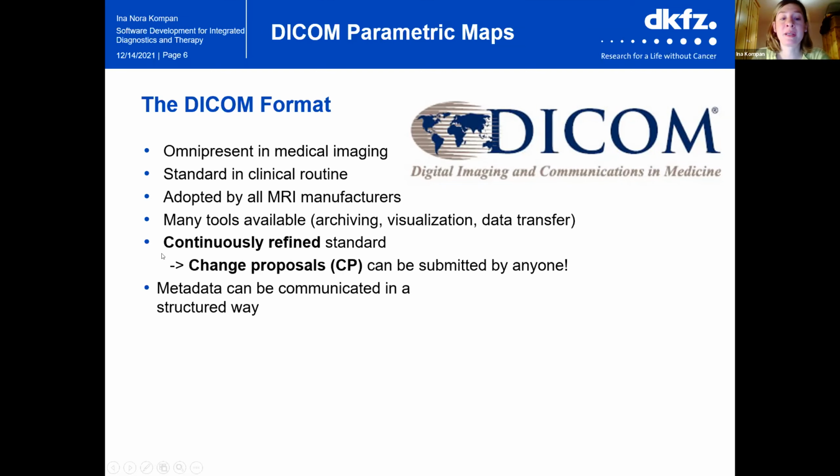It is important to understand that the DICOM standard is not set in stone. However, it's a continuously refined standard to keep up with new developments. And this refinement is done via the mechanism of change proposals. Change proposals can be submitted by anyone, and then they will be processed and reviewed by the DICOM community. And if they have been accepted, they will be part of the next edition of the DICOM standard. And also a great benefit of the DICOM format is that metadata can be communicated in a structured way. I talk more about this in detail later.